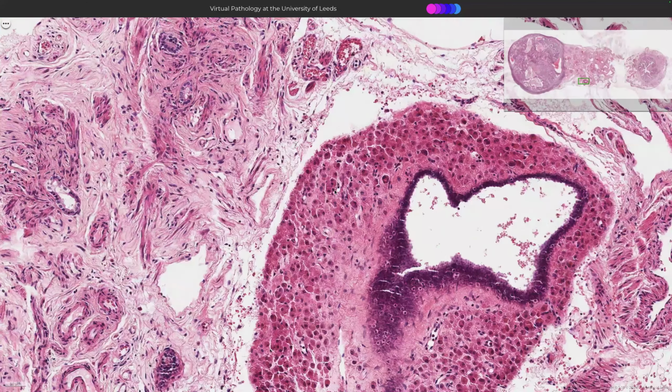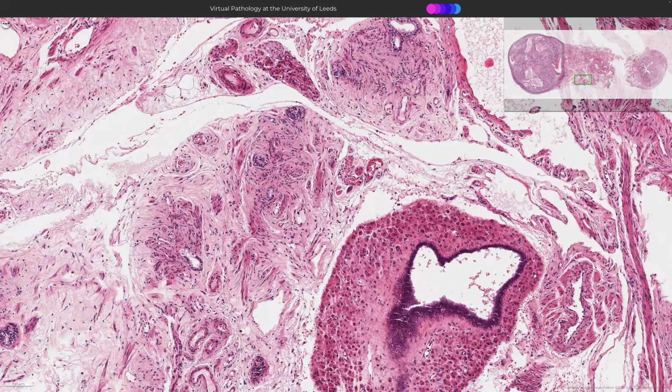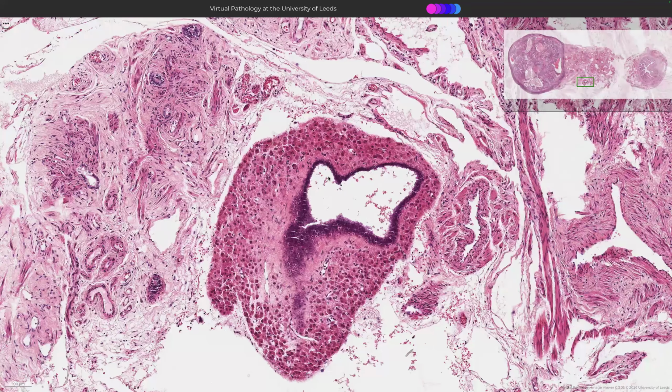Here at the hilum of the ovary, we've got these little chaps. What are these cells? They're cells with copious eosinophilic cytoplasm around a nucleus and prominent nucleolus. What are these? Do you need a clue? They're associated with something that might be a mesonephric remnant. Look, some more mesonephric remnants around here with the smooth muscle.